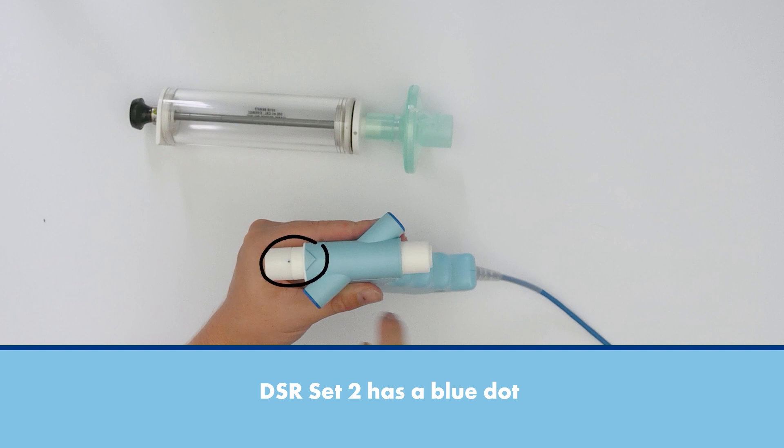For children and adults weighing more than 15 kg, you will need to use Dead Space Reducer Set 2.